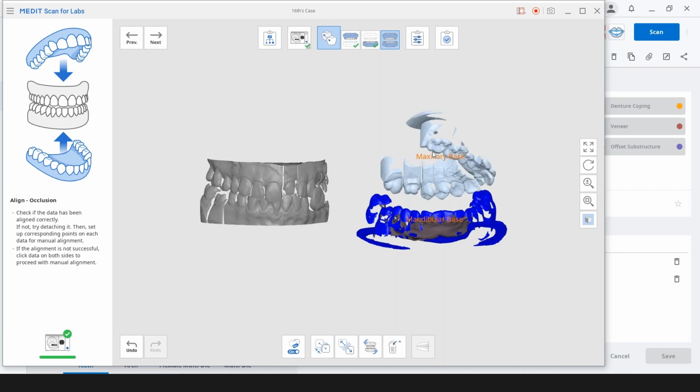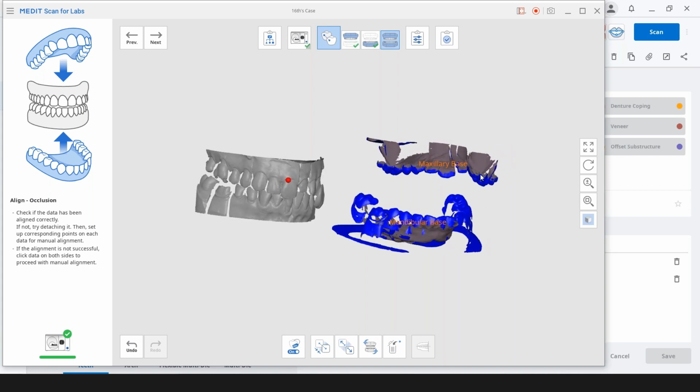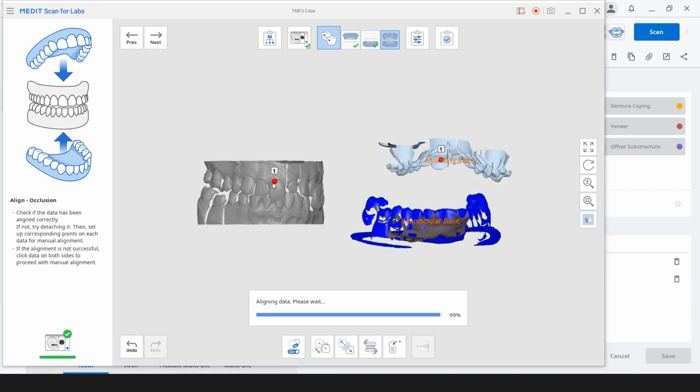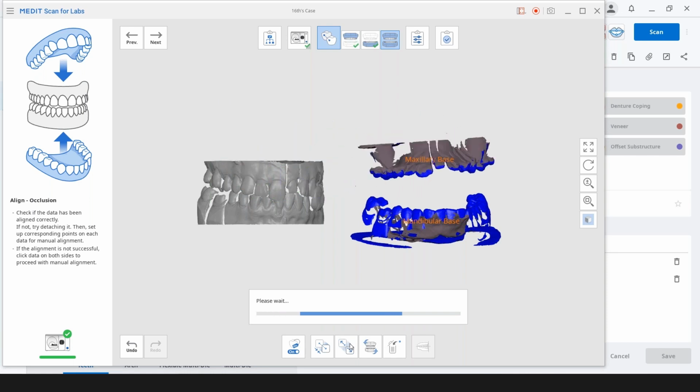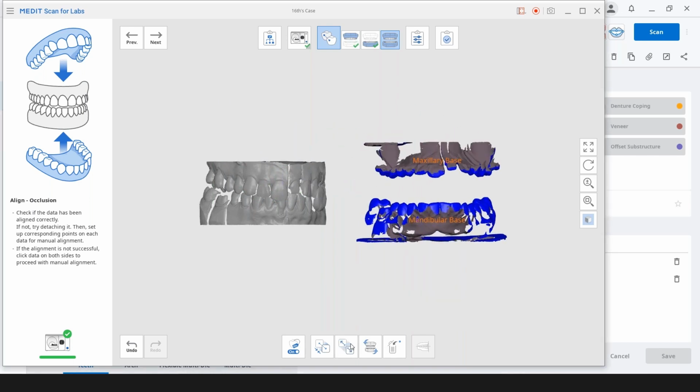So typically they would mesh together basically. Yep, they look exactly the same. And then you can do point matching. You can put the points on there and the point on here. It would basically line up the same as what happened with the die. You can actually separate them and then manually align them with the points. It just manually aligns and then you're done.